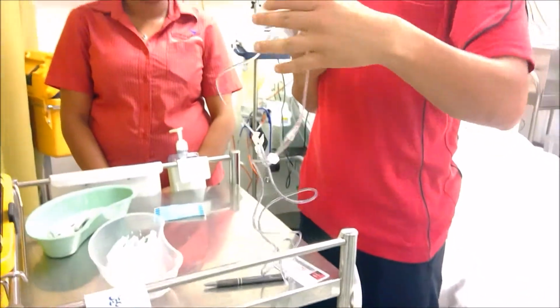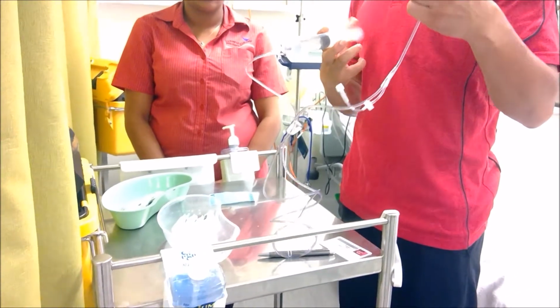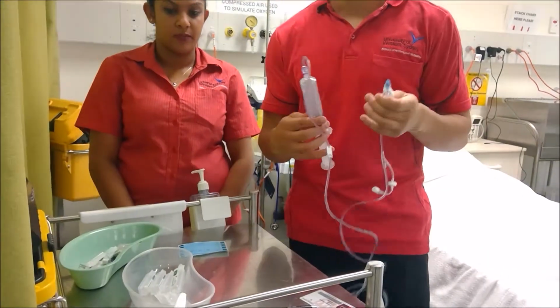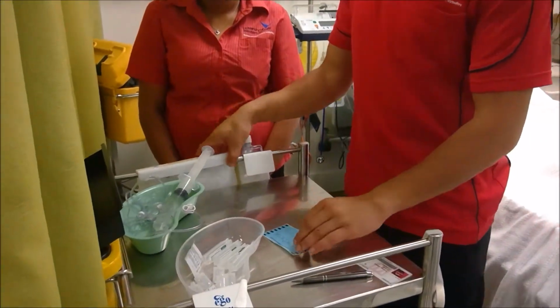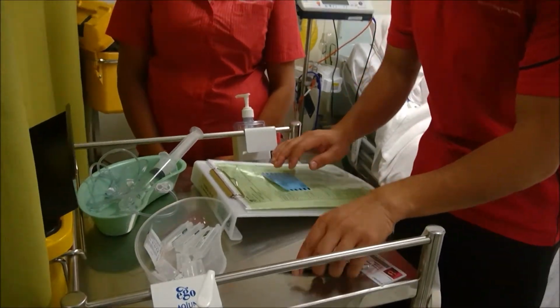Going to prime the line. That's good. You happy with the prime? Yes. Okay. I'm going to fill out the sticker.